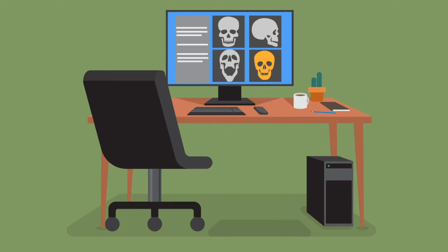Your clinic will have big, bright windows. That is excellent. However, such bright rooms are a disaster for reading radiographs. You will miss important subtle radiographic findings. You may also miss caries, root fractures, and many other important diagnostic clues.